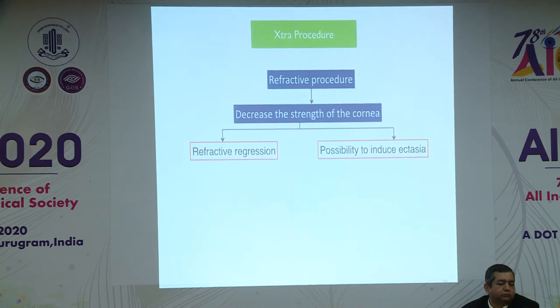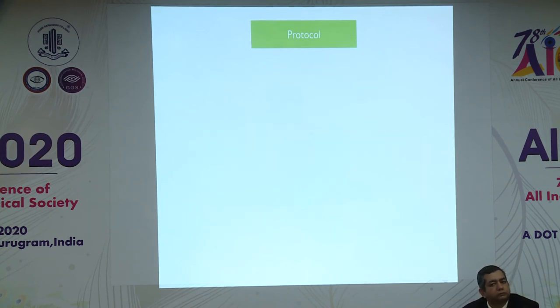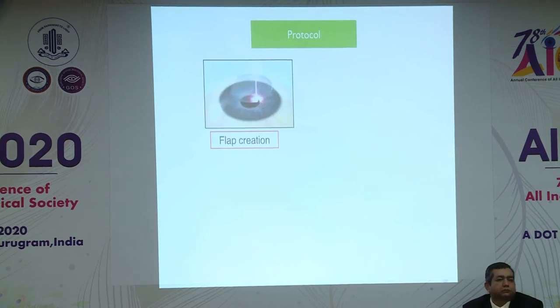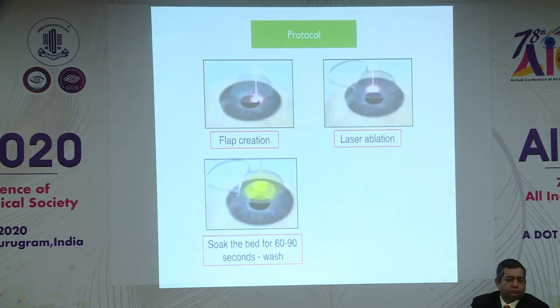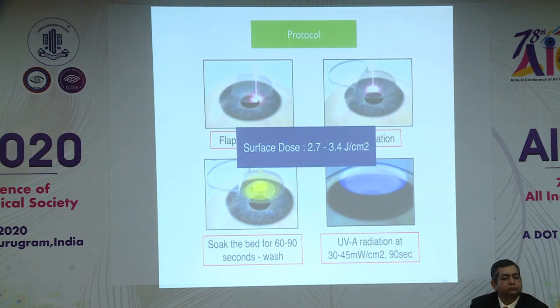And then coming to CXL Xtra, a procedure which is done in conjunction with the refractive procedures, which decrease the strength of cornea. Usually after refractive procedure, there is a chance of ectasia and also refractive regression. More susceptible people are the ones with high refractive error, those which have thicker flaps, and those undergoing recorrection procedures like repeat procedures. So after flap creation and laser ablation, the bed is soaked for around 60 to 90 seconds and the riboflavin is washed off. And then the UV radiation is given at 30 to 45 milliwatts per centimeter square for 90 seconds. The idea is that the surface dose should be exactly half of what we use for keratoconus, so around 2.7.